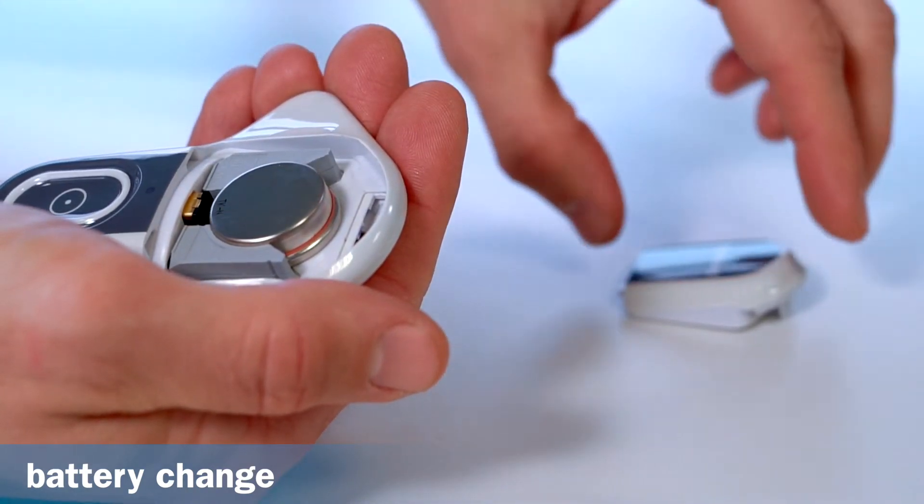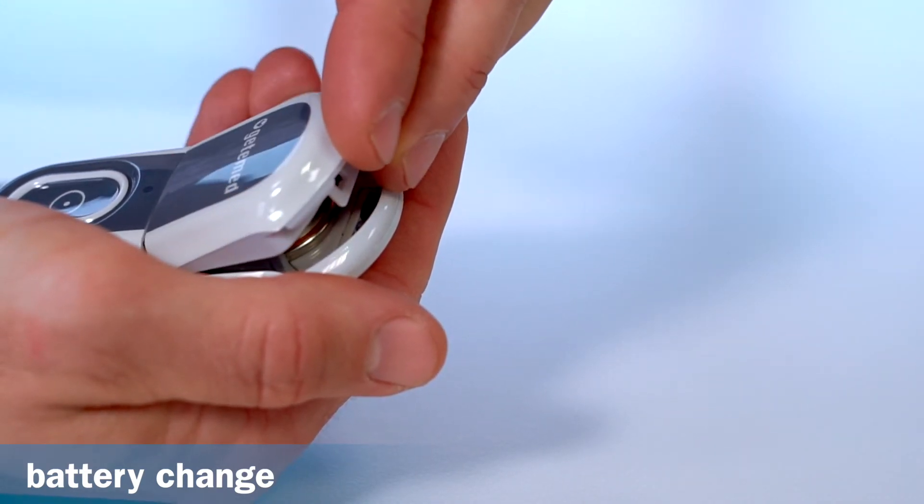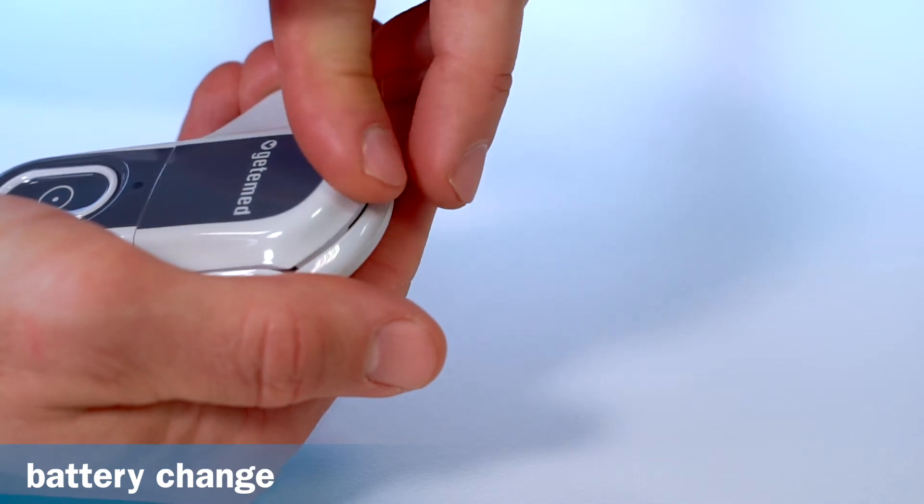To close the battery cover, push the two lugs into the opening as far as they will go, and push the front cover back until it locks audibly.